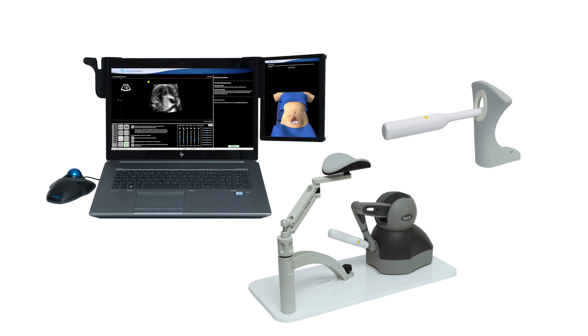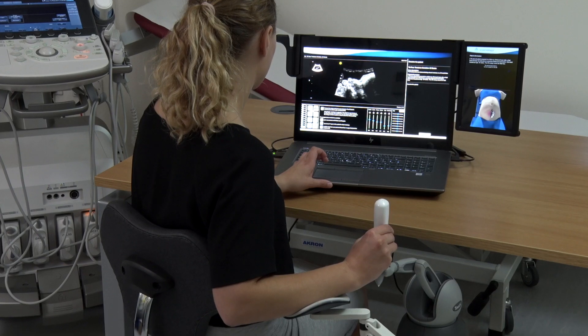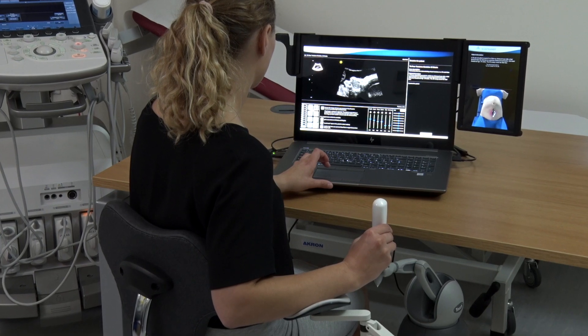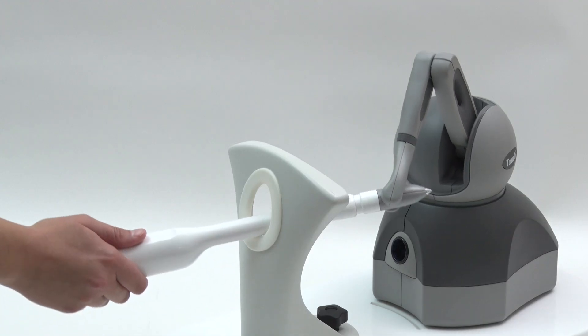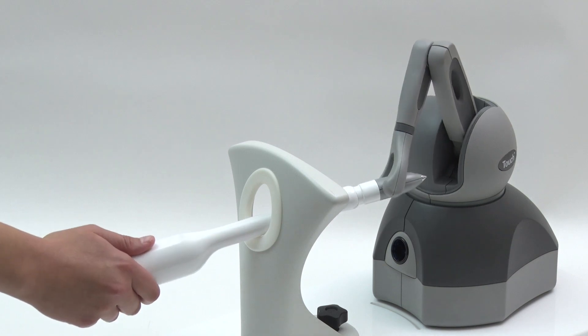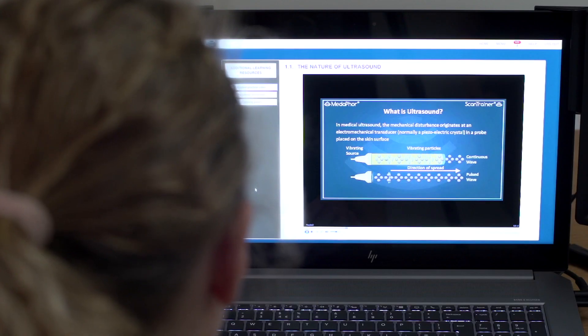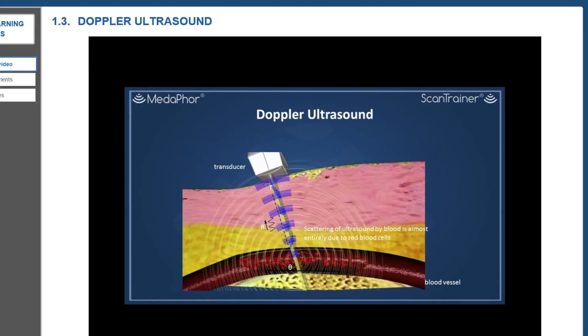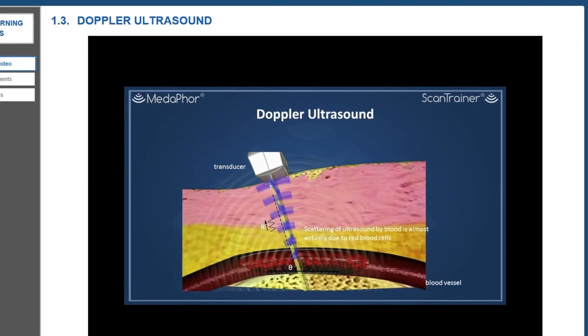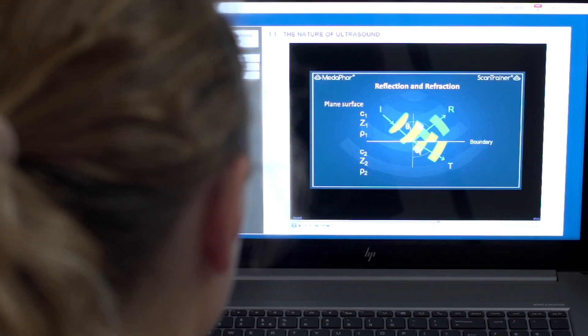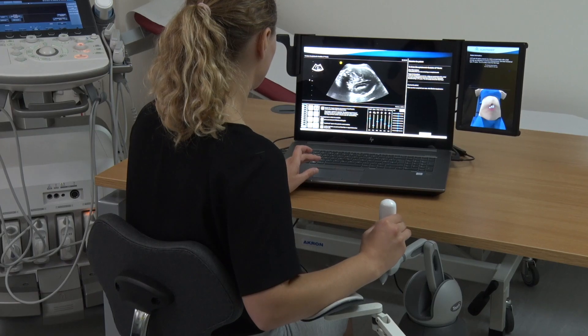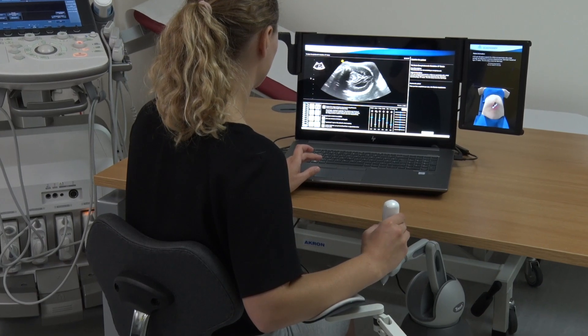ScanTrainer Compact has been designed for medical professionals who wish to learn transabdominal and transvaginal ultrasound. The simulator offers a comprehensive and structured educational pathway from learning basic principles of ultrasound to scanning and diagnosing anomalies and pathology across multiple clinical disciplines.